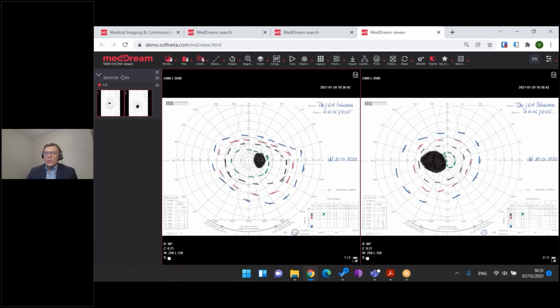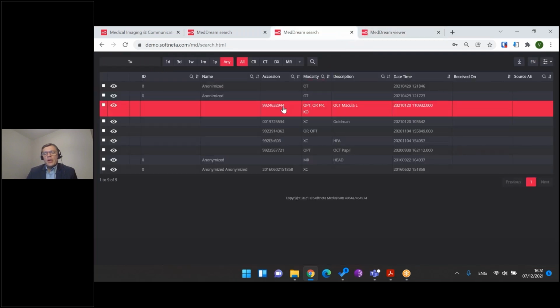I could really say that this is the right moment to present our product for ophthalmologists too. You just need to know one small thing: when we speak about OPT, OCT support, because it's very fresh support, we are supporting only a few devices yet.